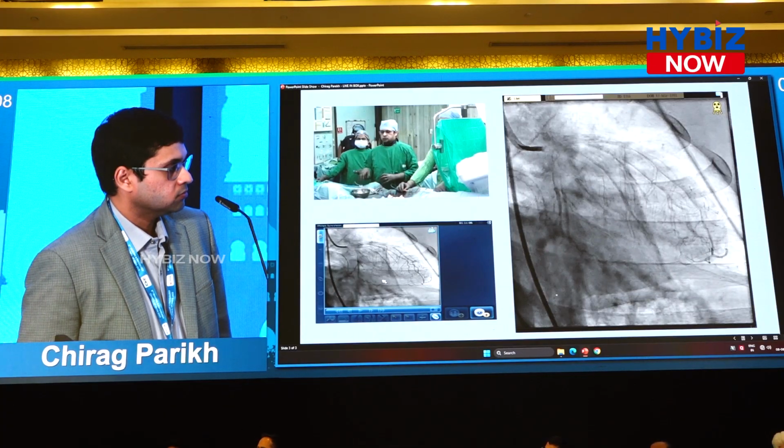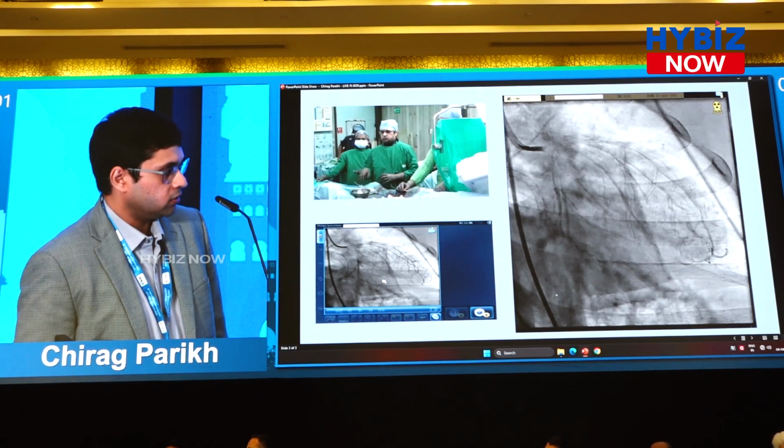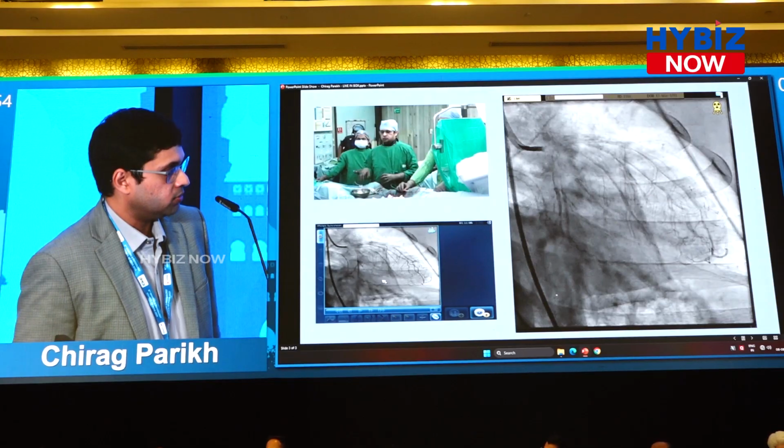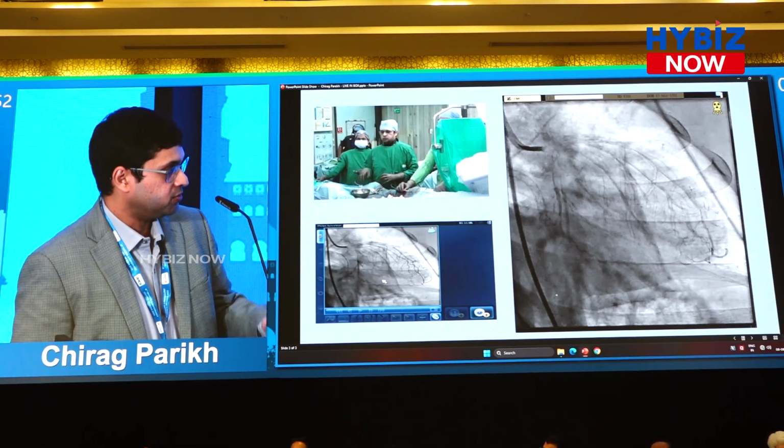One is any ISR, as we are discussing, we have a diagonal issue. You didn't come across the diagonal. I did not want to avoid the diagonal, but we don't know the area above that. We didn't see so well. No, the area above that was reasonable, sir. I had to fit everything in 6 minutes.